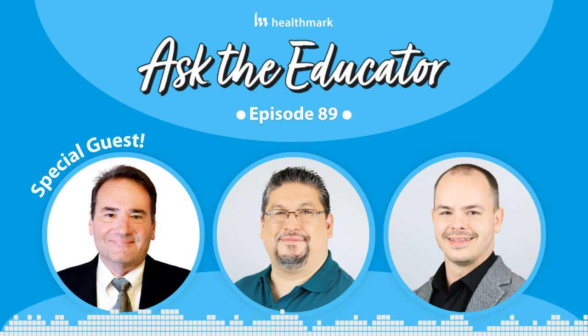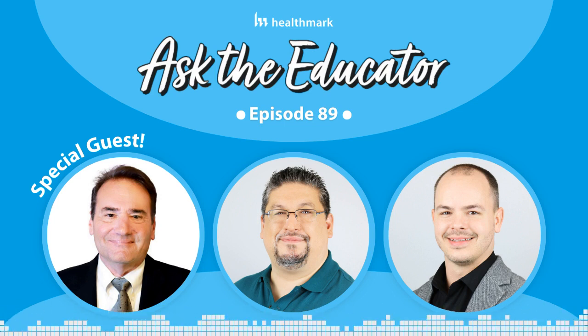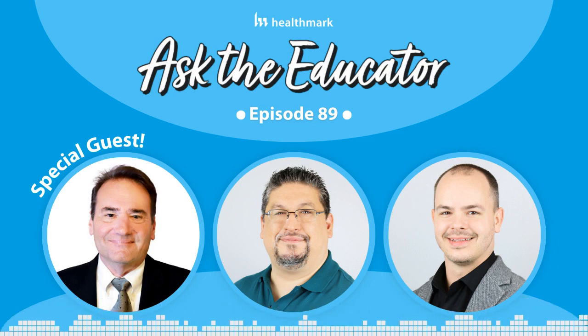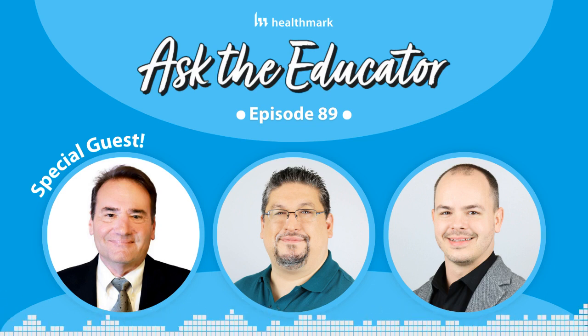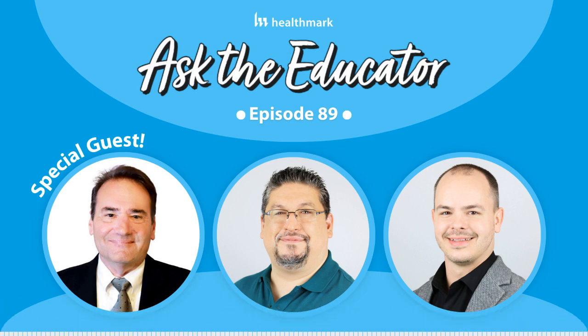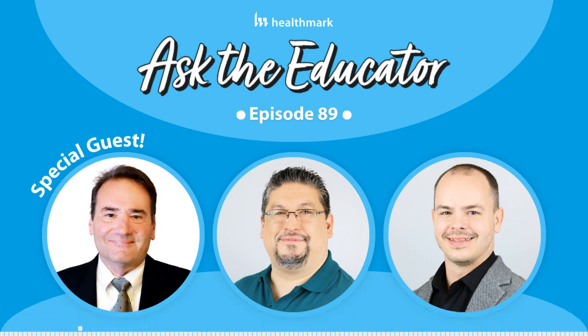And, ideally, what do you think the effect of ST98 is going to have on the industry? Because I see a lot of positive things. If we can have manufacturers be actually testing the cleaning of their actual devices for actual soils or simulated soils that are simulating what you're seeing inside the facility, we should be able to clean to these IFUs. It shouldn't be this kind of thing where we're like, how did the manufacturer ever think this instruction was acceptable? It shouldn't be that anymore, right? This should ideally move us toward a direction where it's moving the industry forward.